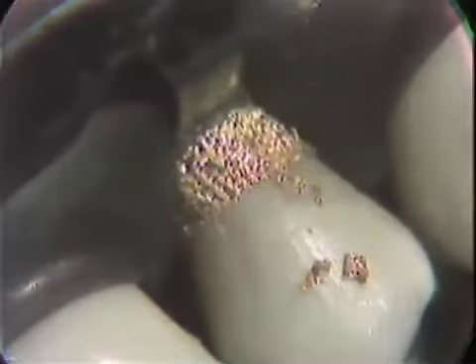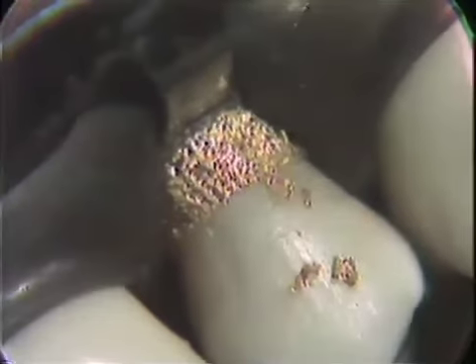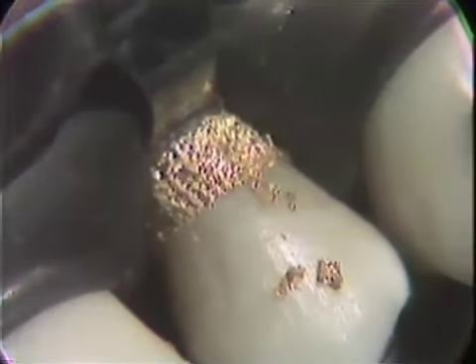All right, condensation now is, I think, complete. One way of checking this is to get a view of the area using a mirror, and we've just now placed a mirror on up into that mesial aspect, getting a view that shows us that we do have some slight excess material there. That should be sufficient to enable us to carry out the finishing.